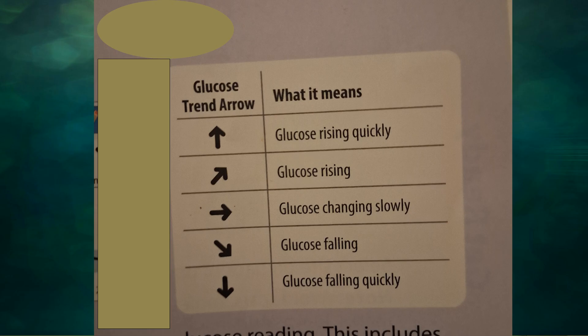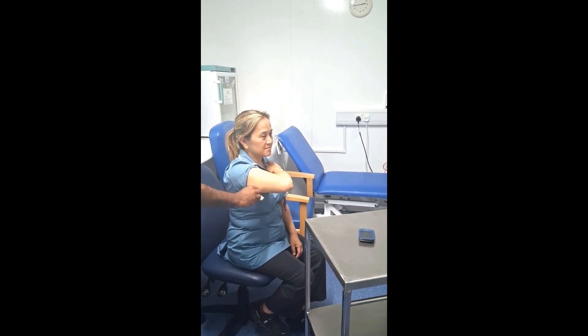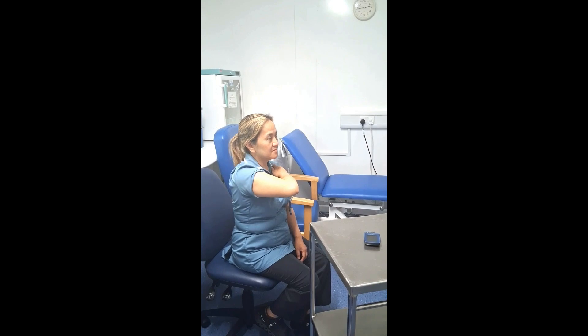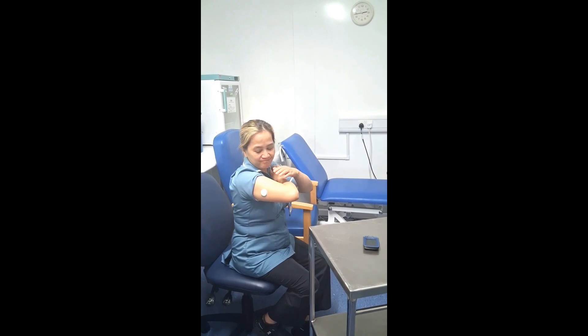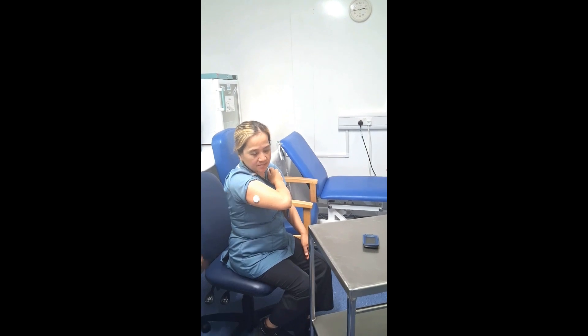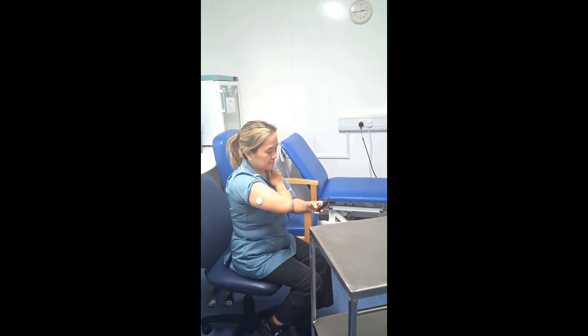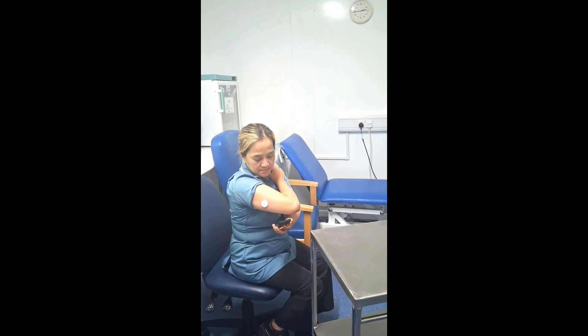An important feature — as I mentioned — is the arrow indicator. You get an arrow followed by your blood sugar numbers, which tells you whether your blood sugars are going upward or downward over the next 15 minutes. First, clean the site with an alcohol wipe. Once clean, apply the sensor and make sure the edges are fixed properly. Then take the reader and scan. The first 60 minutes will be a warming-up period; after that you'll be able to scan every 15 minutes.